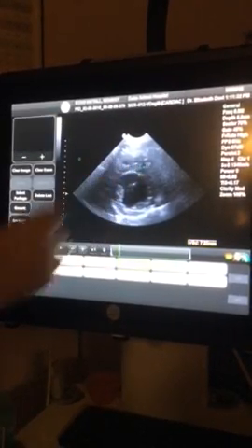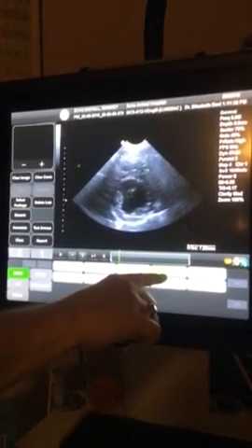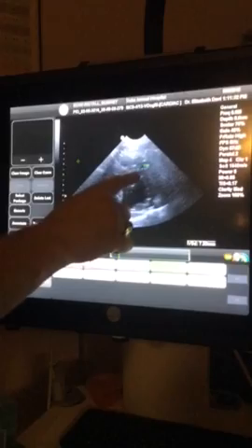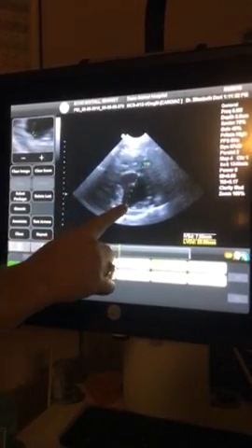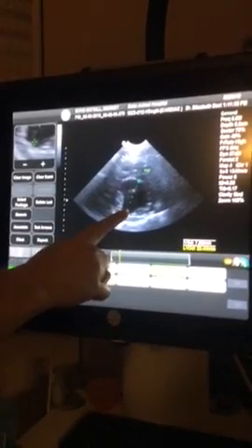Yeah, just don't take the finger off until you're done right in this area and when you're okay with the measurement, okay? So now when you take your finger off, it's automatically thrown into your next measurement inside the mushroom or left ventricular diameter. We're just going to touch that caliper, pull it down. And again, we don't want to take our finger off yet until we're satisfied with our measurement here.